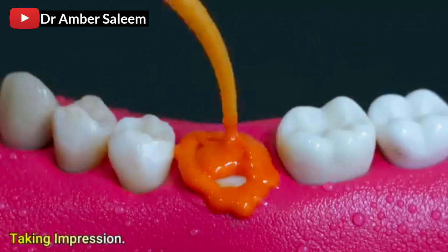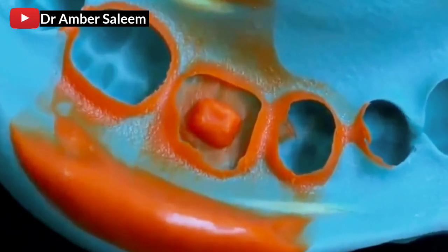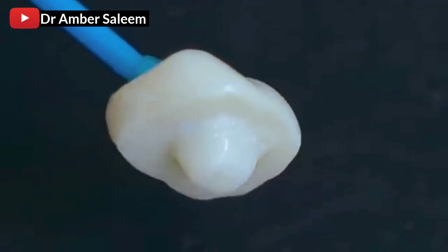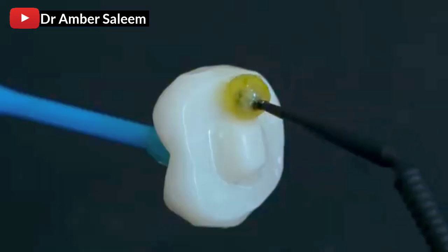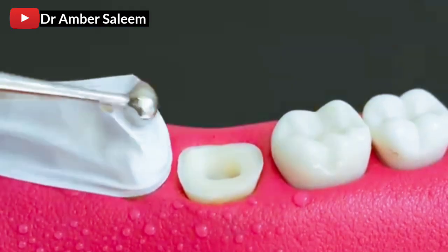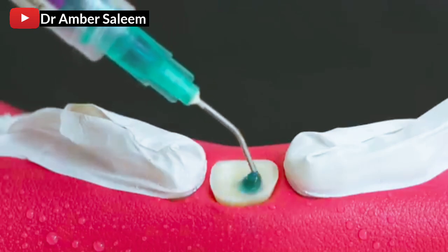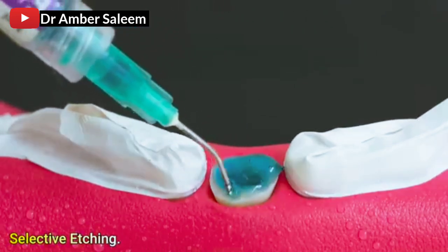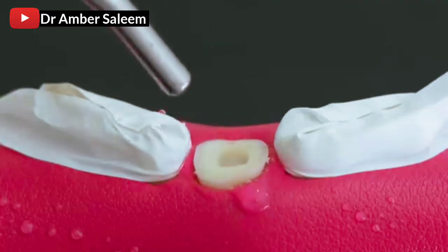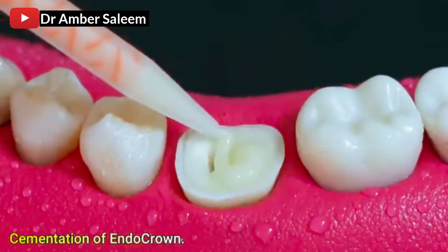Taking impression. Endocrown made by the dental lab. Selective etching. Cementation of endocrown.